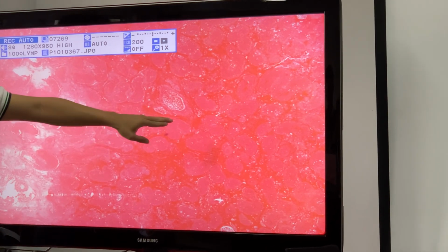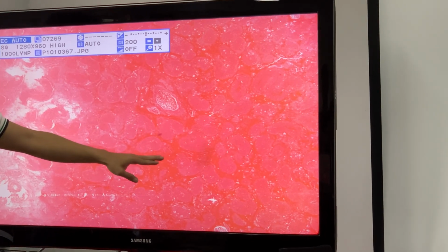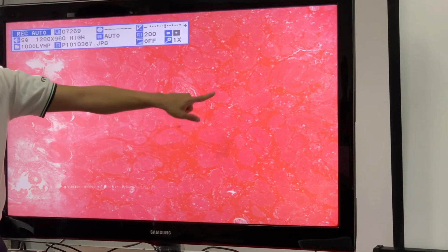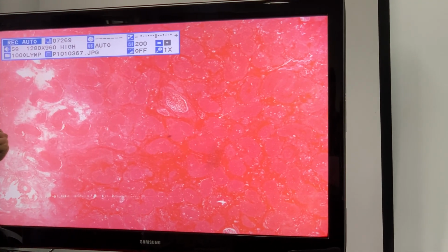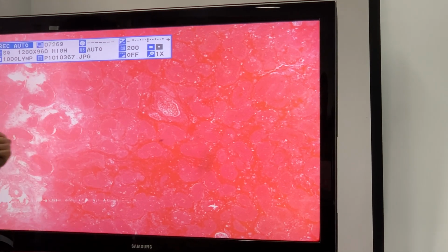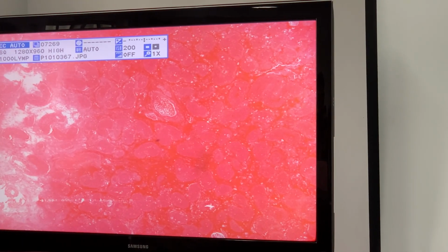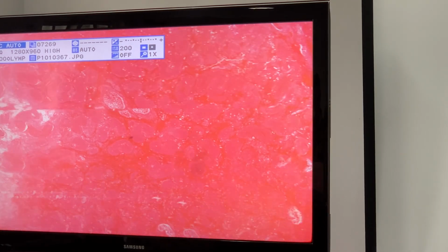And what you see is a lot of hemorrhage. There is blood outside the blood vessels. The cells here have died, but they maintain their shape, their architecture. This is coagulative necrosis. The diagnosis is testicular torsion. This is a hemorrhagic infarct. Testicular torsion.